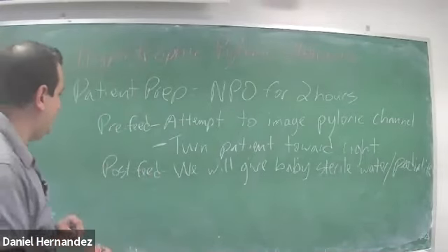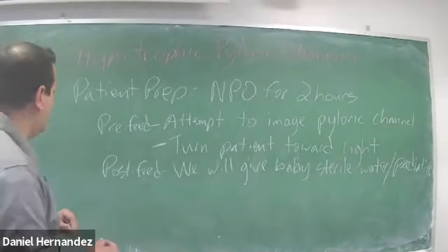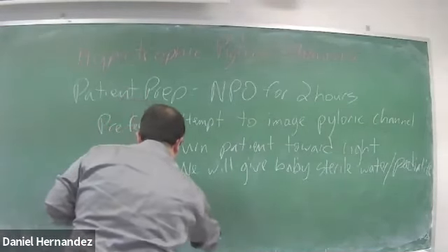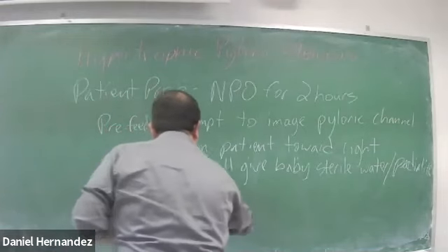Then you're going to fill the stomach, and now you're going to re-image the pylorus channel.